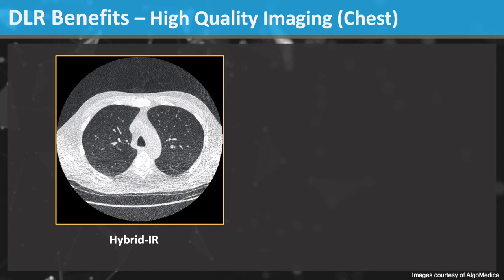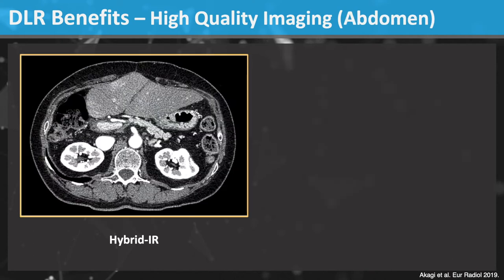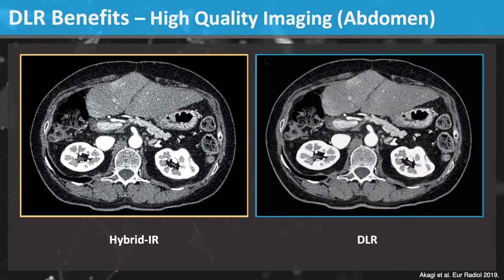This chest CT has high image noise despite using current reconstruction methods. DLR reduces image noise and improves image quality, which could improve diagnostic accuracy. This abdominal CT also has high image noise despite using iterative reconstruction. DLR reduces image noise and markedly improves image quality. These are actually thin-slice images, but they look amazing.